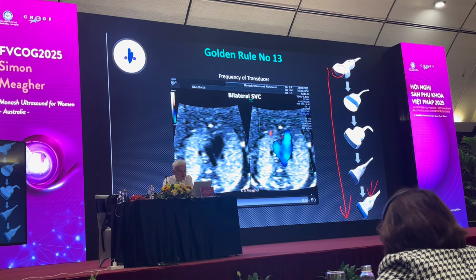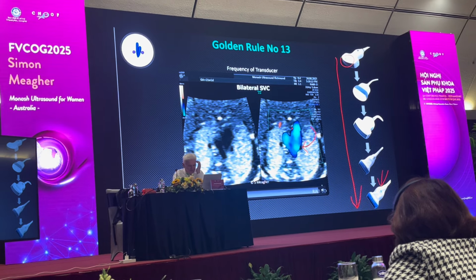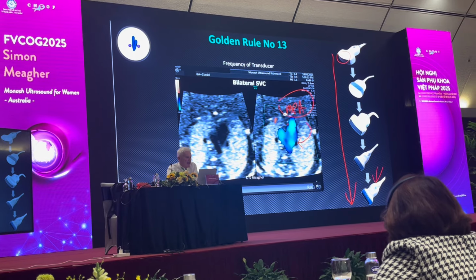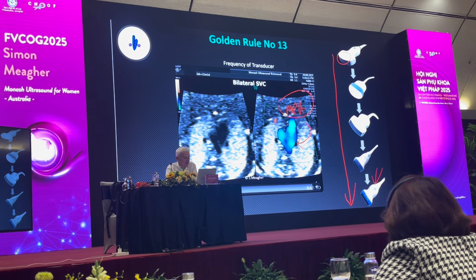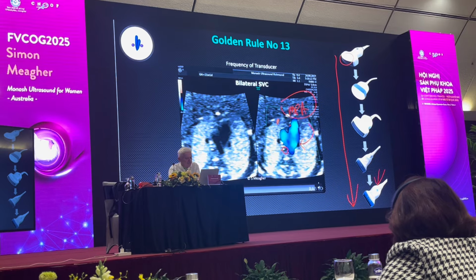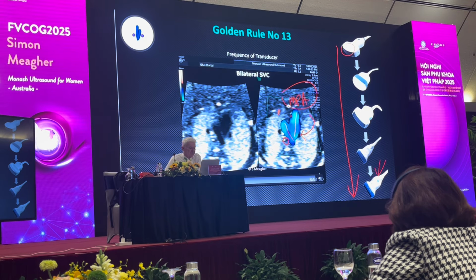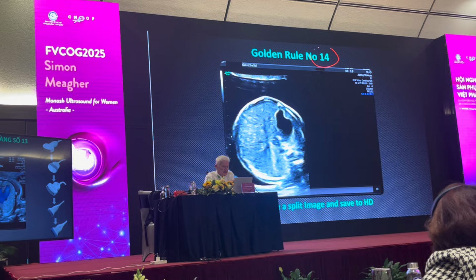This is a baby where this is the extra vessel that's sitting beside the pulmonary artery. There should be no vessel beside the pulmonary artery, ever. So this is a baby with a persistent left superior vena cava. But I know it's the pulmonary artery because that's the trachea. And I know there's laminar flow, there's no reversal flow. That's applying different rules.